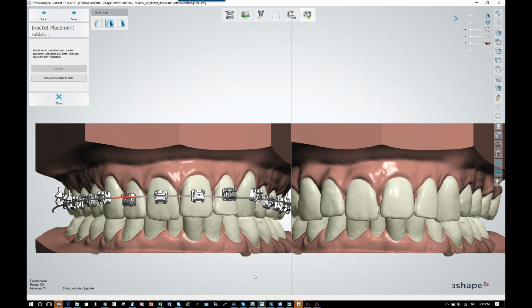And then if you don't have the equipment, then you don't need the bracket transfer. And then later on you acquire your own printer and some equipment, then you can always add that. So we want you to be able to utilize the software. We don't want to throw you into something that you're not going to utilize anyway. But the good thing about it is you can always add it later on.